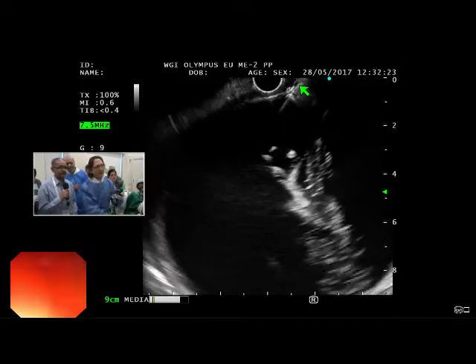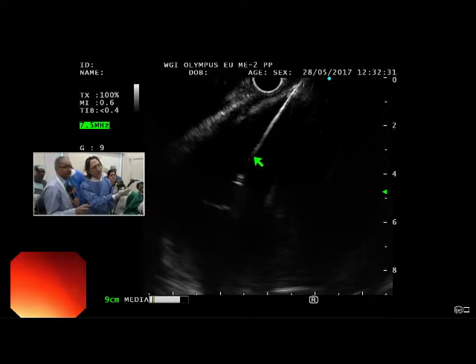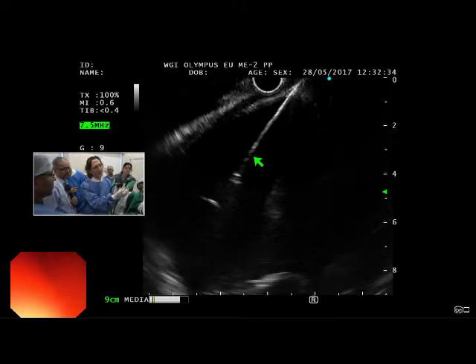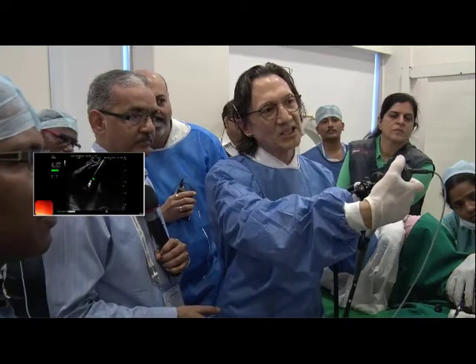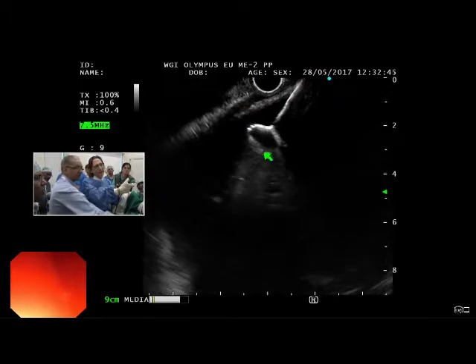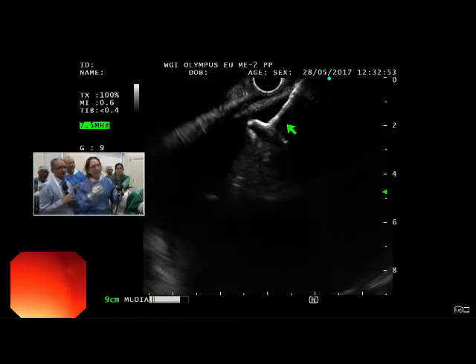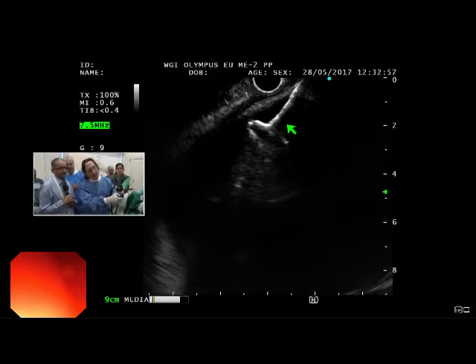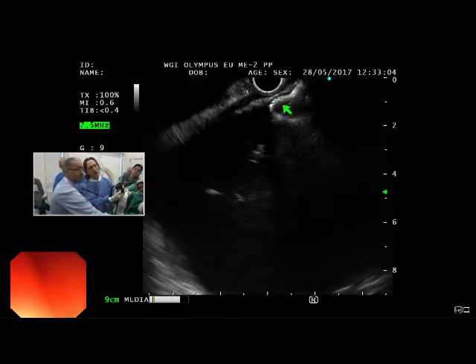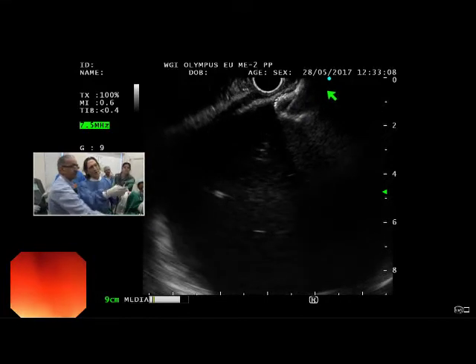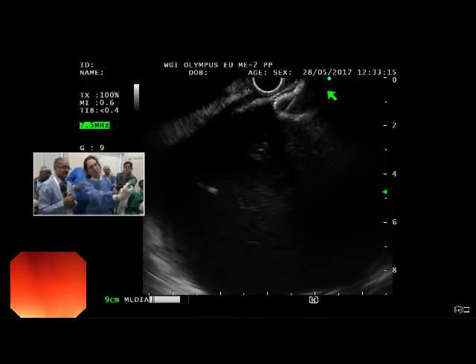Now I'm inside. I'm going to advance the catheter. I've locked. I'm going to take off the yellow safety pin. Now I'll unlock the gray hub and pull back on the gray hub until it clicks — you're going to see the distal flange deploy. When it clicks, the distal flange is fully deployed, and I don't need to do anything. I can wait as long as I want. When I'm ready, I'll unlock the sheath and pull it back, snugging it up against the wall until it starts to deform just a little bit, then relock. Now I'm ready to deploy the proximal flange in the working channel of the echo endoscope — I just pull back on this gray hub.